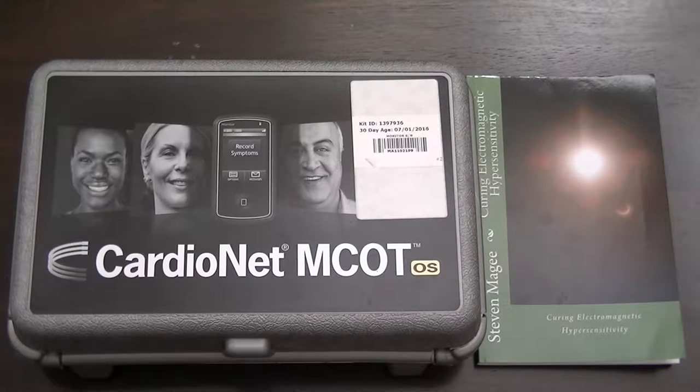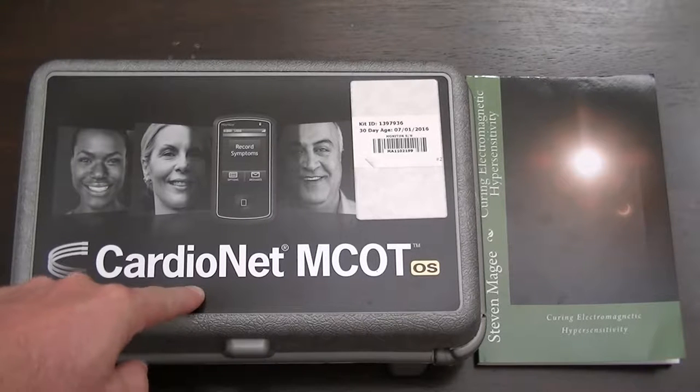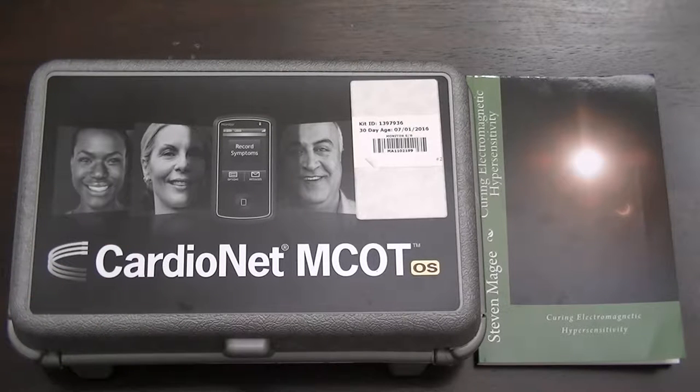Hi, my name is Stephen Magee and I'm the author of Curing Electromagnetic Hypersensitivity. I'm here to take a little look into this device. It's a CardioNet MCOT heart monitor and it's called a holter in the medical profession. It's a little device that has three electrodes and it connects to your chest and monitors your heartbeat continuously.